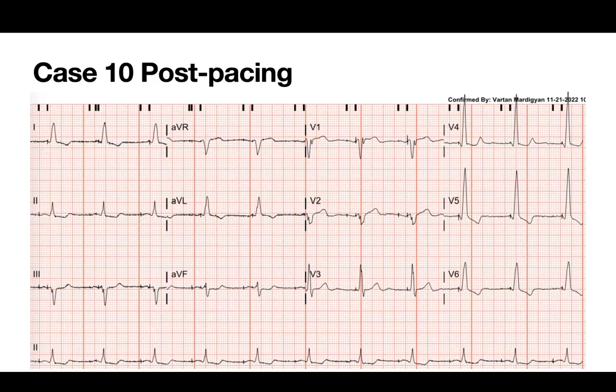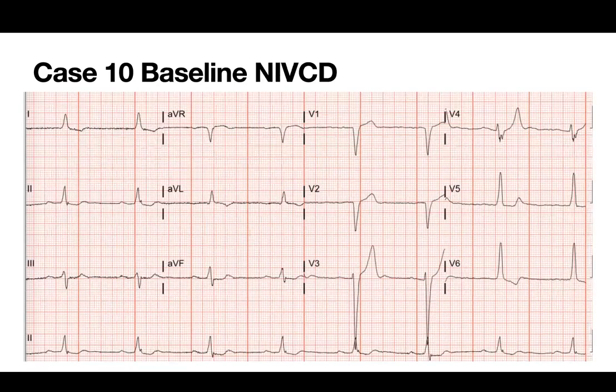Point being, with these cases, I really look carefully at the baseline ECG before I start the case. And if I have time, I take a quick look at the echo too to see the septal thickness. So I know the information going in, you don't get surprises, and you know what to expect. It shortens the case so that you don't get into trouble. But I find those cases tough, because does the baseline ECG really predict that it's going to be a hard case? I'm not sure.